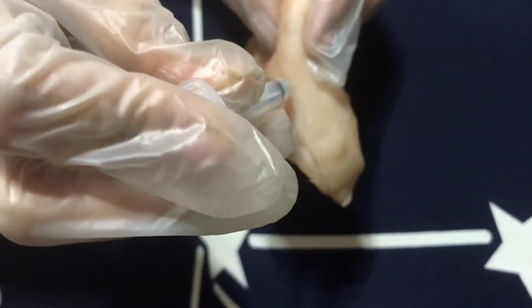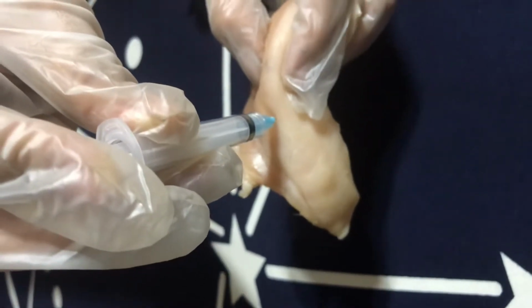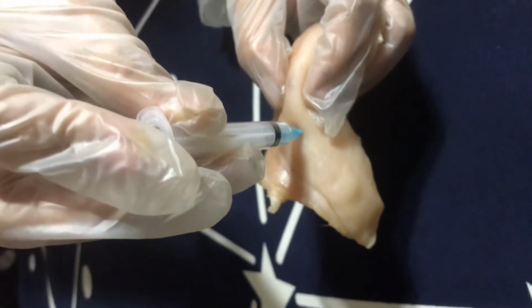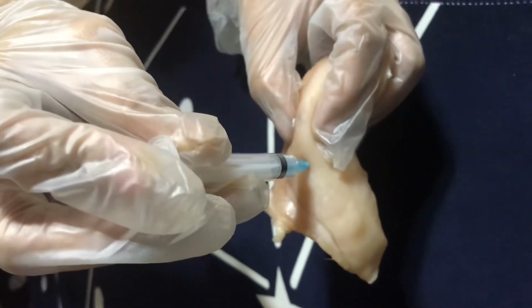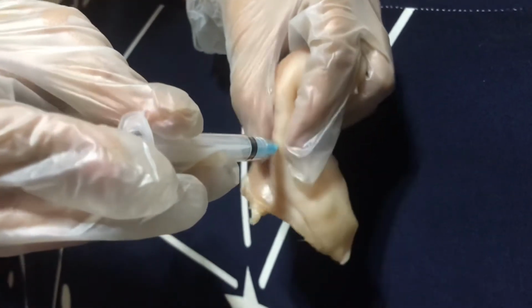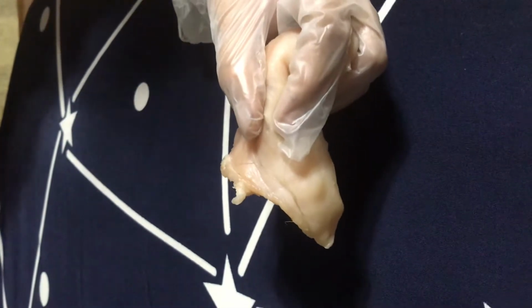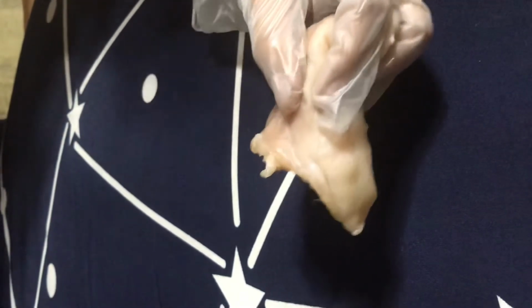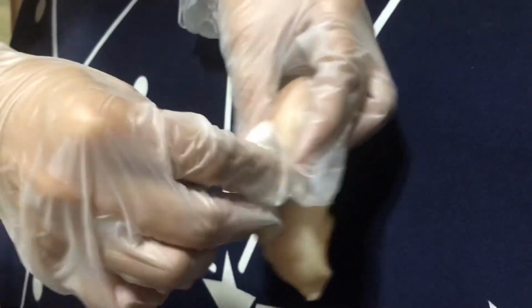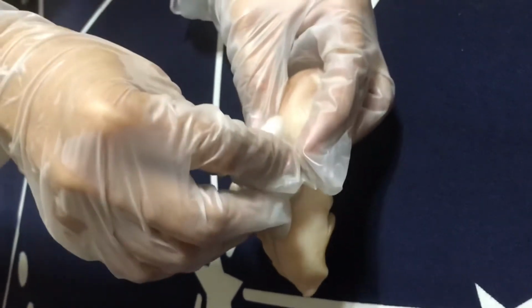So quickly withdraw the needle and place a swab or gauze pad on the site and apply a gentle pressure but don't massage. Cotton. Right. Okay, I will withdraw the needle and place it in the hypodermic tray again and put a pressure on the injection site with a cotton ball, but don't ever massage.